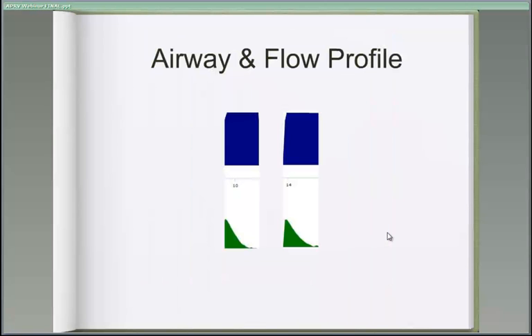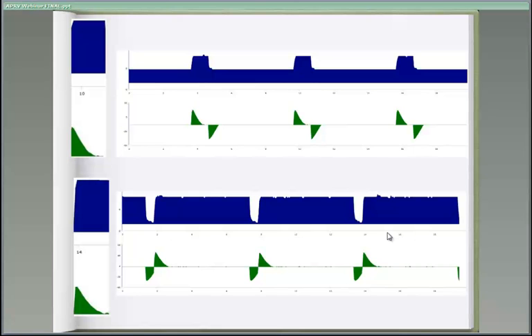So let's look at this a little bit more carefully. If you take the pressure and flow, which again is what the lung responds to, and you look at it more carefully, we are actually extending the time without extending gas flow or volume. There's a no flow state over a period of time. What we're trying to do is equilibrate the lung volume so that the lung has an opportunity to fully recruit itself. And this may be key because one of the reasons that we may want to manipulate an airway profile is to sort of match the physiologic response of the lung.